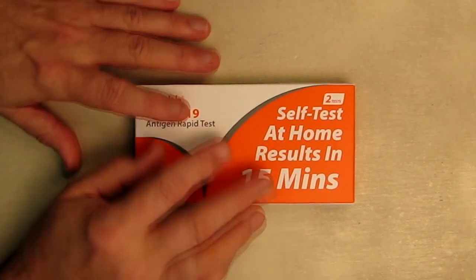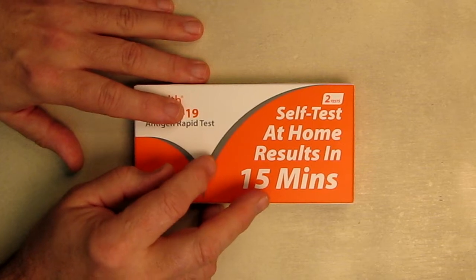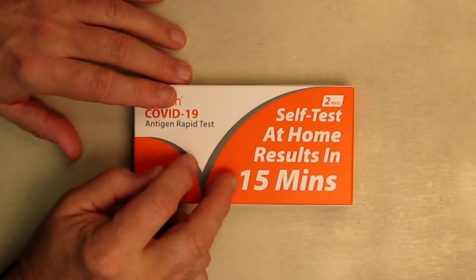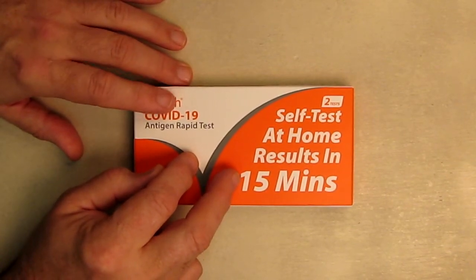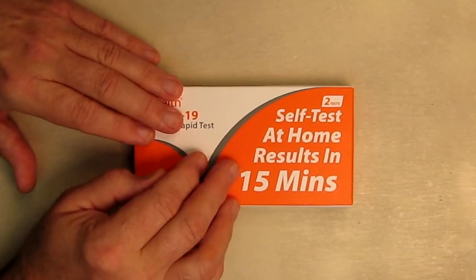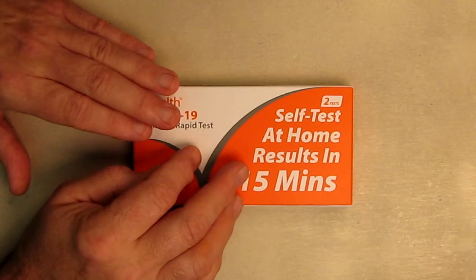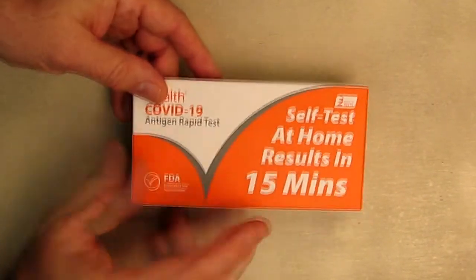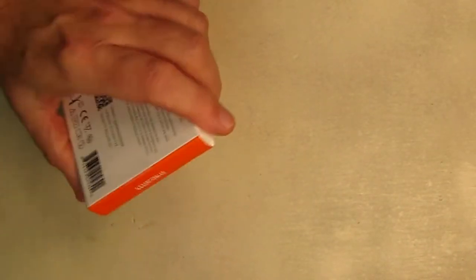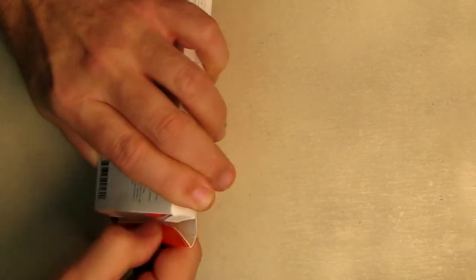I'm going to open this up but not the individual packages, because I want to make sure we use them right before the Christmas party. I can show you what's in the kit, and I'll also include the video presented on Amazon by the company showing exactly how to use it — I edited that video, took out all the fluff, so it's shorter and gets right to the point. The box has a little seal on it so you know it hasn't been tampered with.